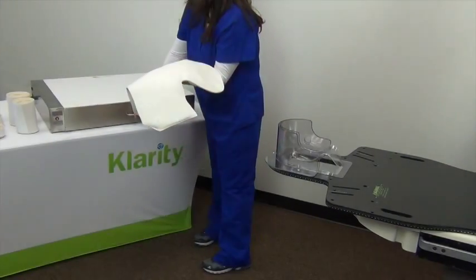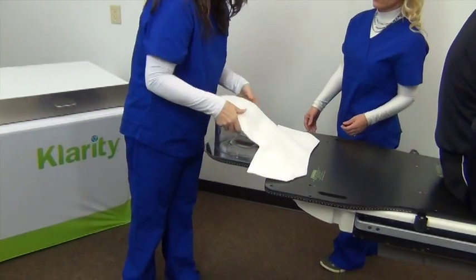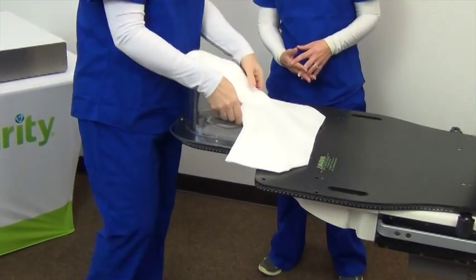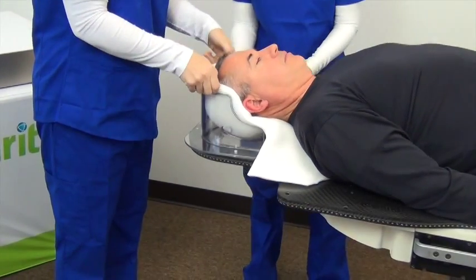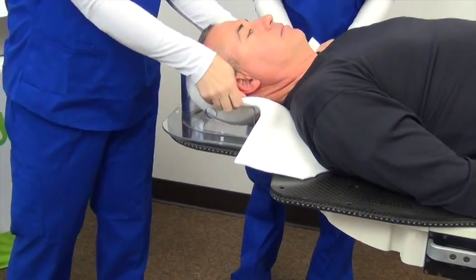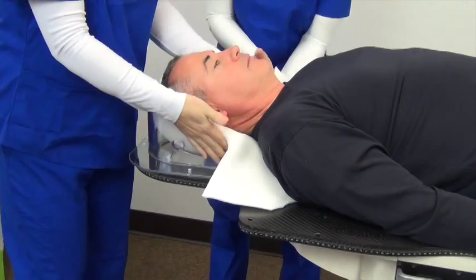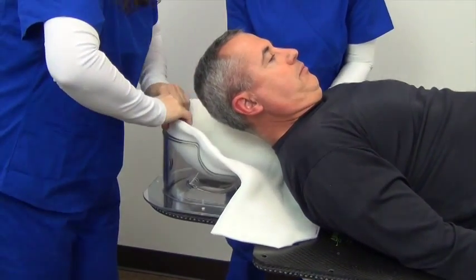Have your patient sit up and remove the shell cushion from the oven. It will feel warm and soft to the touch. Place the cushion directly above the outer shell mold, leaving one inch of the cushion hanging over the top and sides of the outer shell. Firmly hold onto the top of the cushion and have your patient lie back and press their head into the shell mold until it is comfortably resting. You can repeat this process as many times as needed to get a secure and comfortable fit.